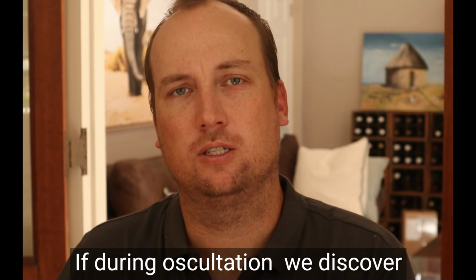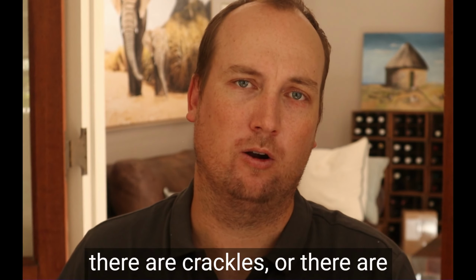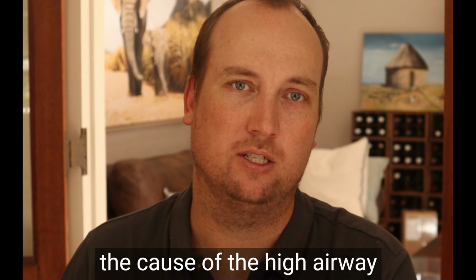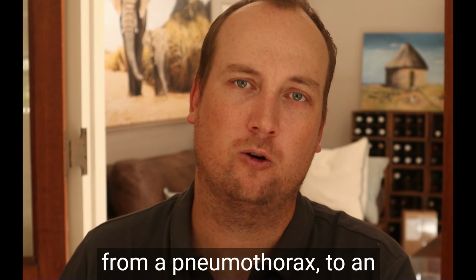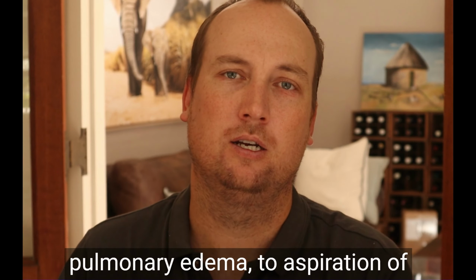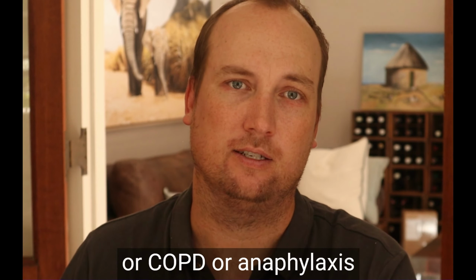If during auscultation we discover that there is bilateral poor air entry into the chest, or that there are crackles, or there are wheezes, or there's no air entry into one side of the chest, well then we've identified the cause of the high airway pressures is at the patient end. And these could be anything from a pneumothorax to an endobronchial intubation and unilateral lung ventilation to pulmonary edema to aspiration of gastric contents to bronchospasm or COPD or anaphylaxis.